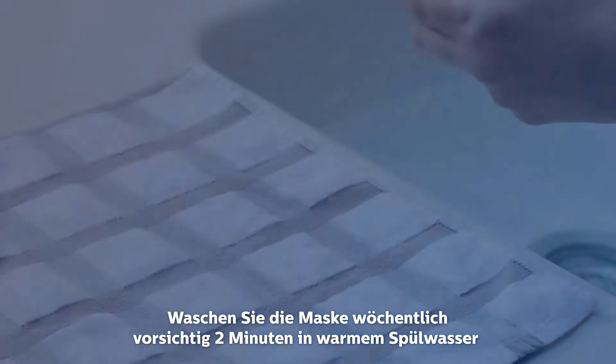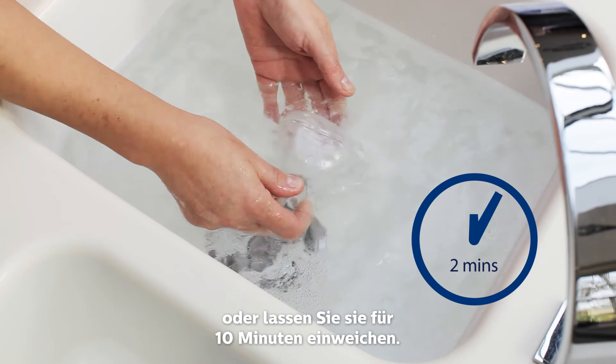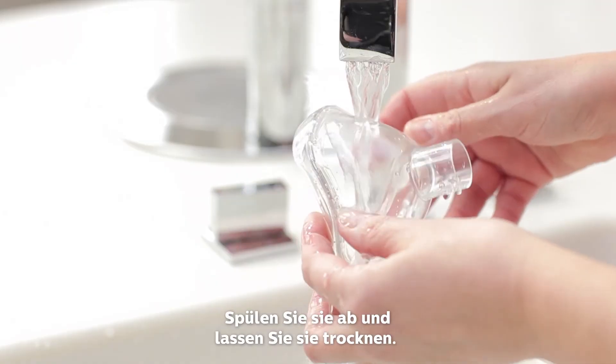Gently agitate the mask in warm soapy water for 2 minutes, or soak for 10 minutes. Rinse and air dry.